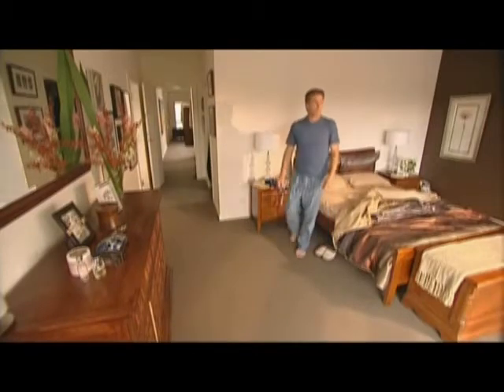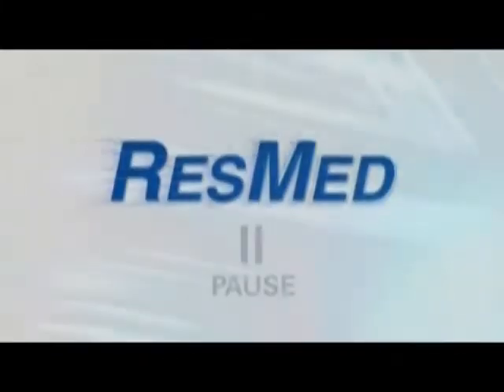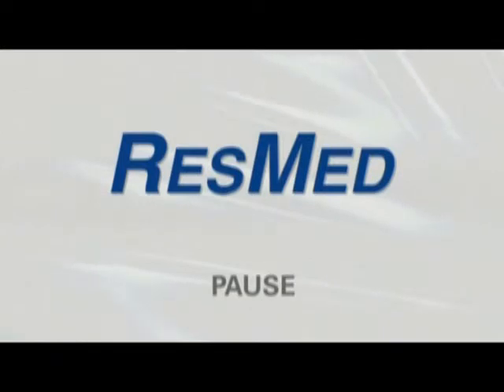Now it's your turn. Pause the video here and practice putting on, adjusting, and removing your Mirage Liberty.